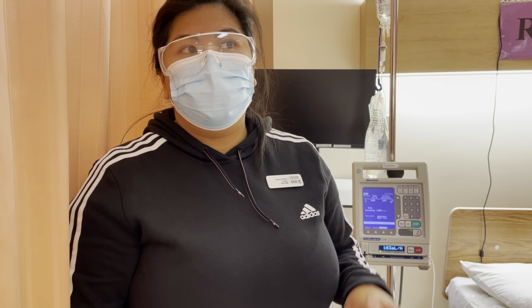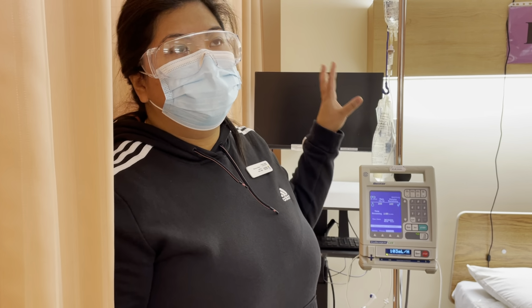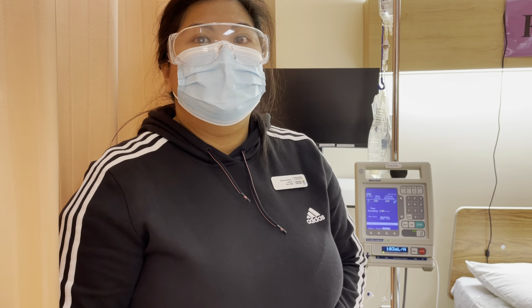And I'll also program a 15 cc flush, and also when I come back I'm going to make sure that the primary is back up and running. And that's it. Thank you.